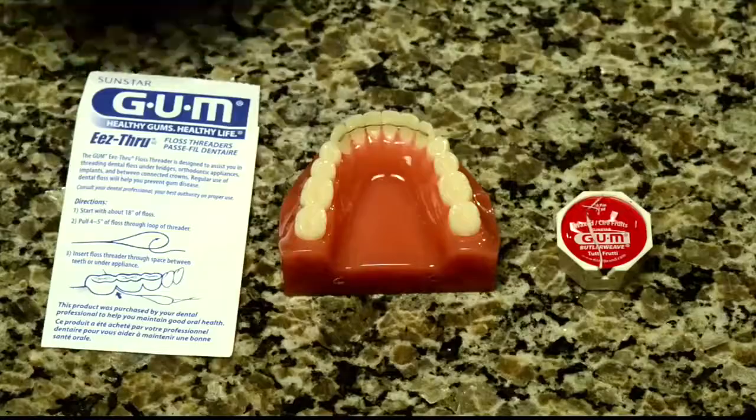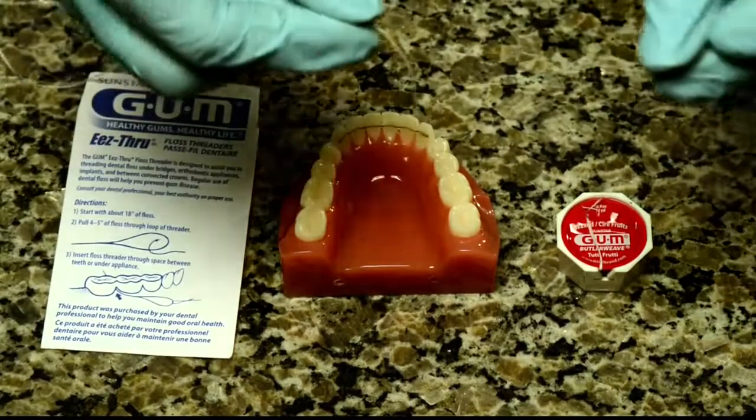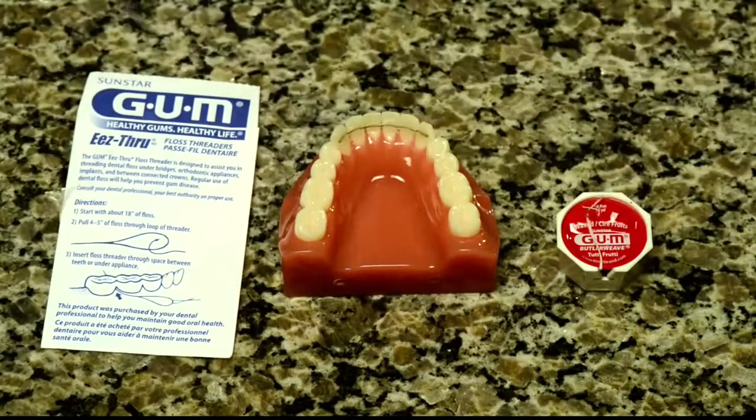The bonded or permanent retainer needs to be flossed daily using floss and floss threaders. Floss threaders are plastic and reusable until they break. You take a short piece of floss and thread it through the floss threader like a sewing needle. You then take the floss threader and thread it in between your teeth underneath your bondable wire.